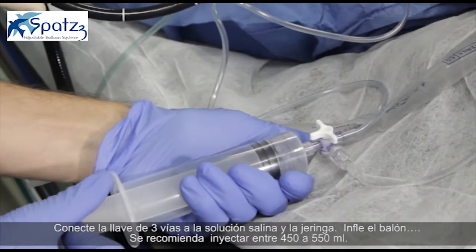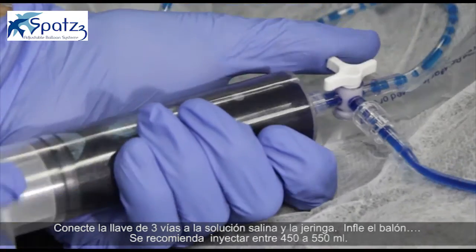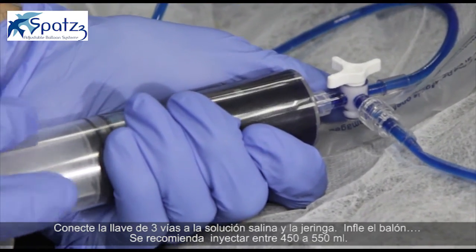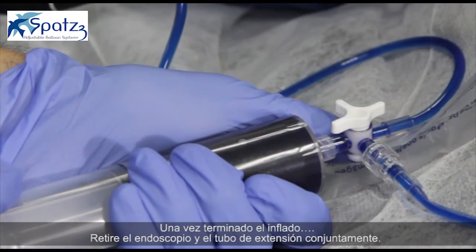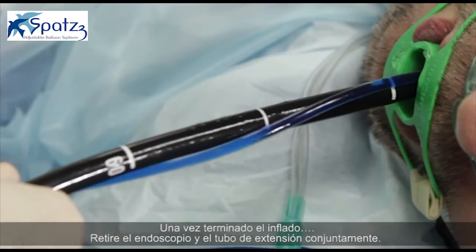Attach the 3-way stopcock to the saline bag and the syringe. Inflate the balloon. We recommend 450 to 550 cc's. Once inflation has concluded, withdraw the endoscope and the extension tube together.